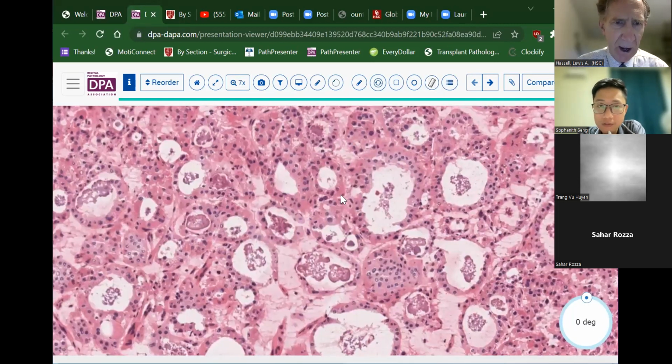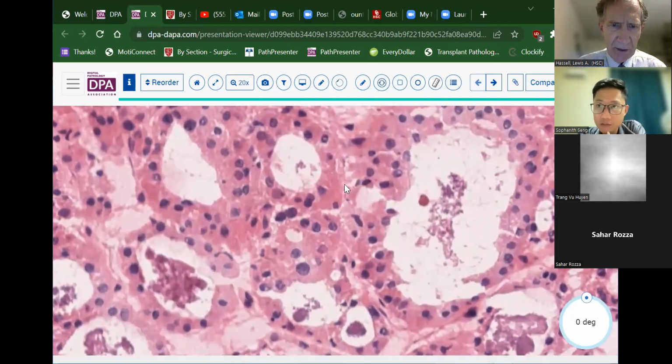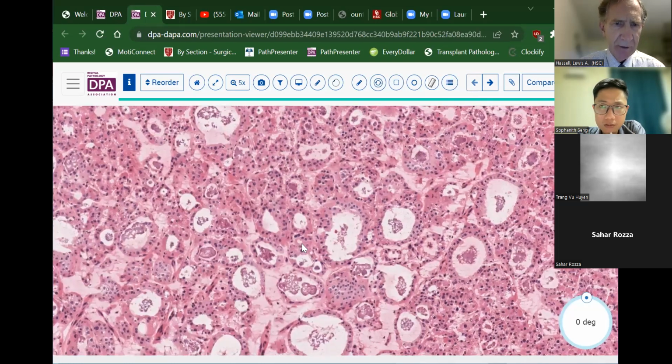And I think you can see now that these are quite eosinophilic cells, a lot of eosinophilic cytoplasm lining these open spaces, which we might refer to as follicle-like spaces. And the nuclei are really quite round. You can see they're really quite uniformly round and fairly even. So even though our cytology with frozen section is not optimal, we get the sense of a very low-grade appearance to the nuclei.